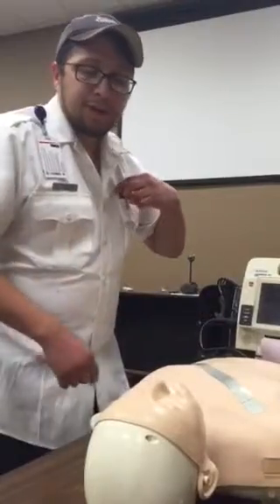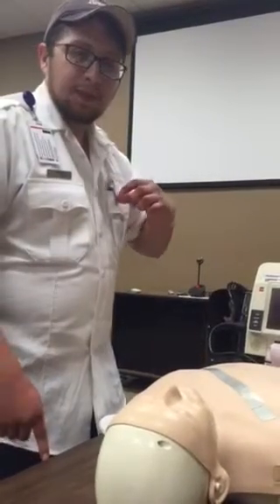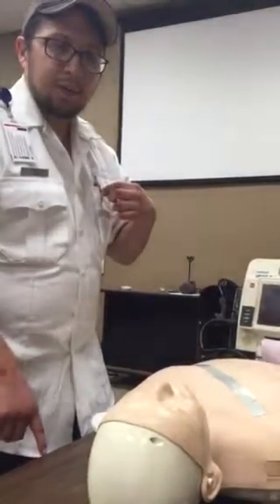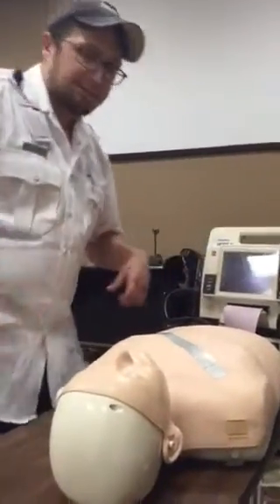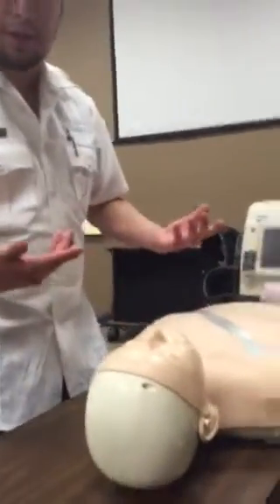I'm gonna go ahead and get a set of vital signs on my patient. Blood pressure is 110 systolic. She has a respiration rate of 20. She's sitting 94% on room air. She has a pulse of 120. Okay, any history of cardiac issues or anything like that? She has high blood pressure, she says. Okay, I'm going to go ahead and have my partner hook up my patient to a 12 lead while I ask my patient to see if she's allergic to any medications or anything like that. Patient says she's not sure if she's allergic to anything, but she doesn't believe so.